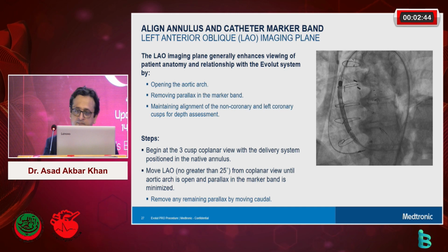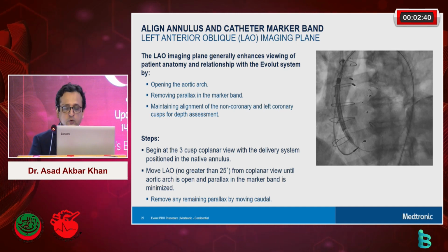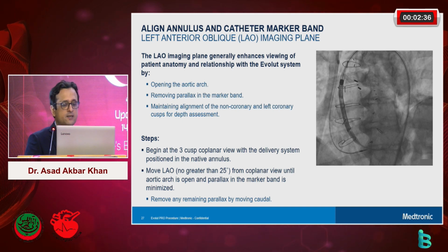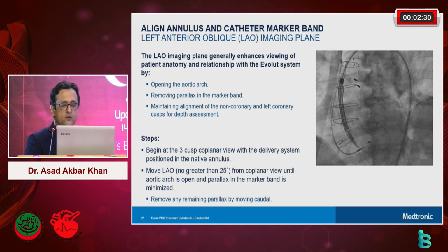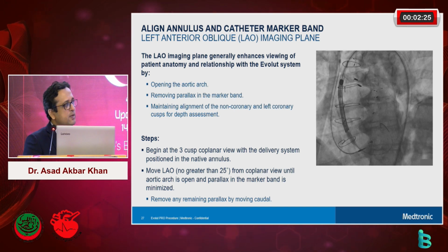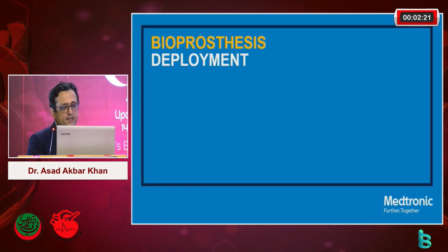So there is blood flow going to the rest of the body. You have not occluded the outflow tract. So you can take your time, because this is where your main deployment position is going to be. You can take all the images that you want, unless you have not done pre-dilatation, because in that case you might be obstructed. So this part is done very slowly. This is the first phase. So you start deploying it.